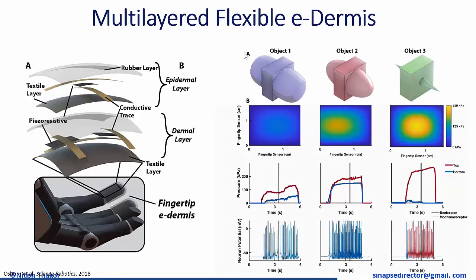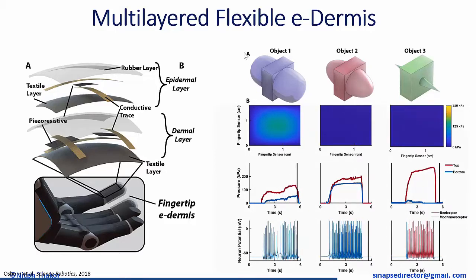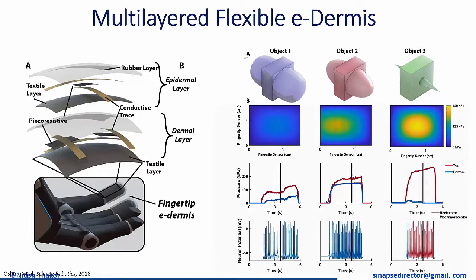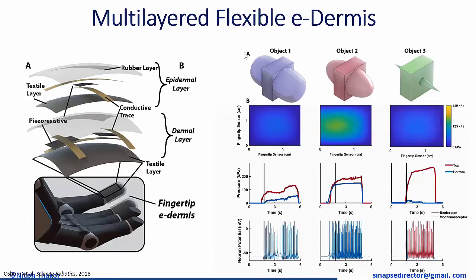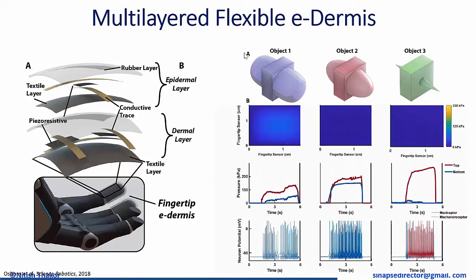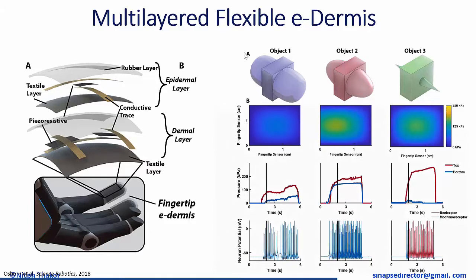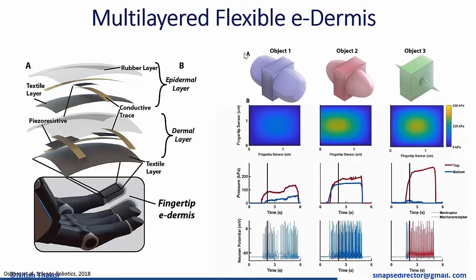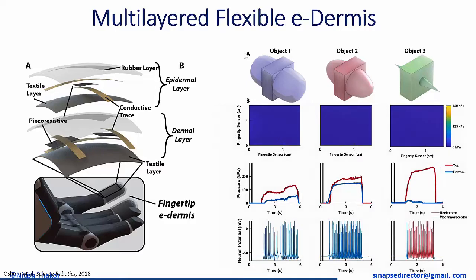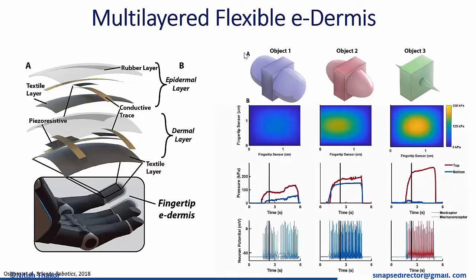And at the very bottom, you see the spiking activity. So now, using this sort of multi-layer sensor, I should be able to perceive the shape of the object from round to very sharp. And it's encoded in this nerve activity that you see in the bottom right. Again, where we are going with it is to improve the perception, the feeling that a prosthetic hand is going to have. So it's possible now by doing this multi-layer sensor and neuromorphic encoding.